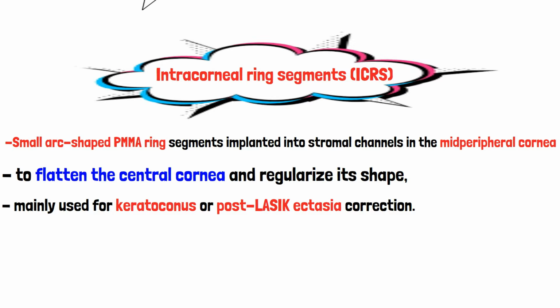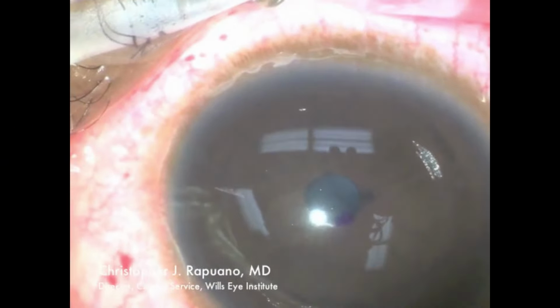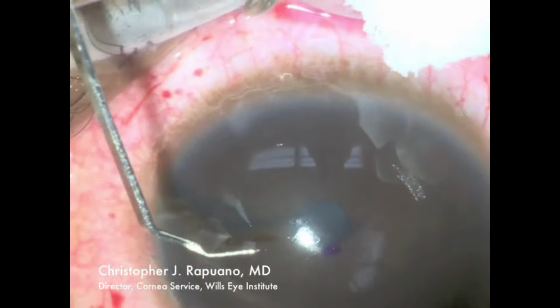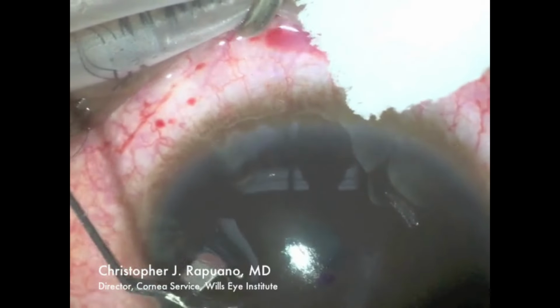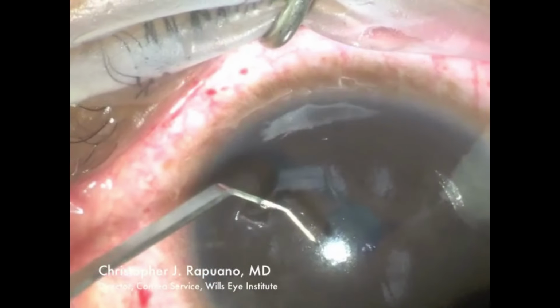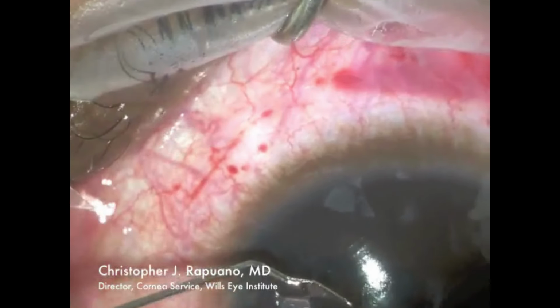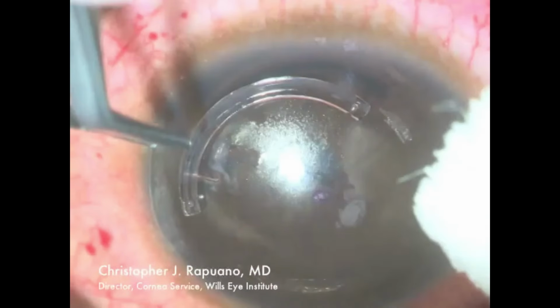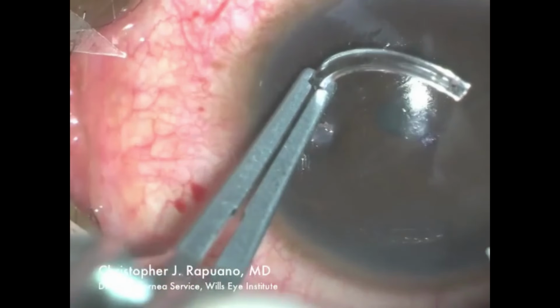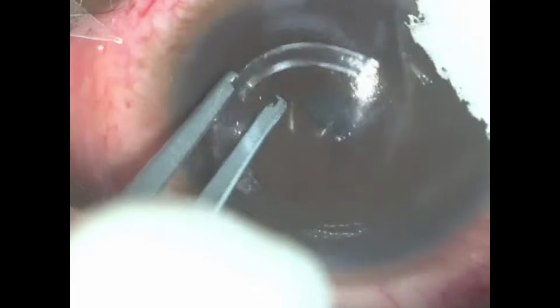The femtosecond laser has already been used to create the corneal channels for the intacs segments. Small air bubbles in the cornea can be seen at the 2 o'clock and 7 o'clock positions in this view. A Y spatula is being used to widen and open the beginnings of the two segment insertion areas. A deep corneal incision was also made by the femtosecond laser at 9 o'clock in this view. Here, a 450 micron Intacs segment is being placed in the inferior aspect of the cornea.